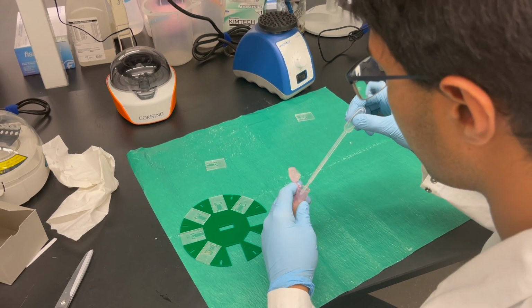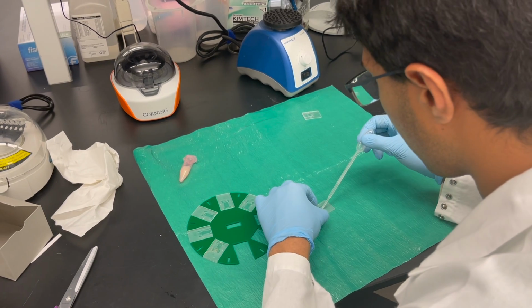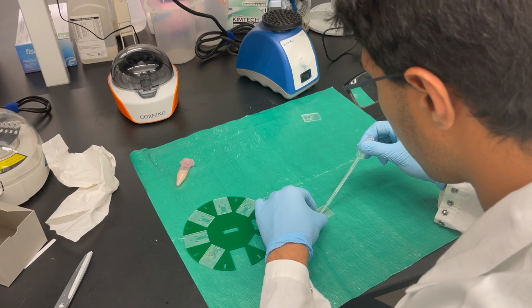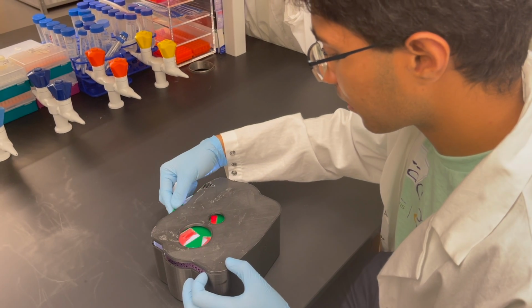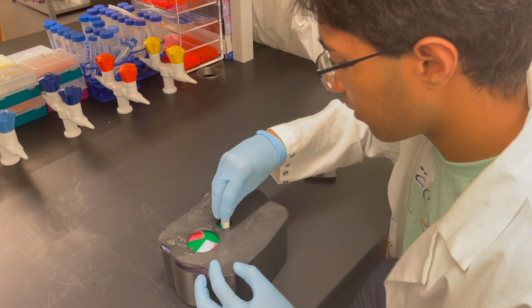First, the slides will be prepared using a 1-to-1 ratio of stool and saline to homogenize the sample. Next, the 8-well slides will be placed inside the device and the turnkey will be used to rotate the slide. Each channel's depth provides visualization of a single layer of eggs, and this avoids error from eggs overlapping.